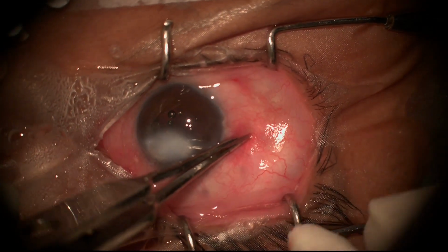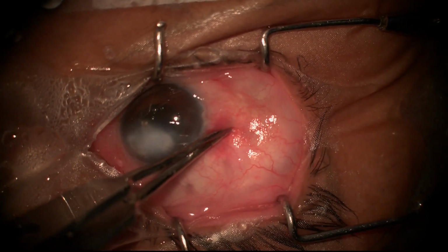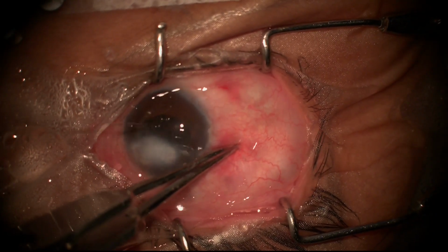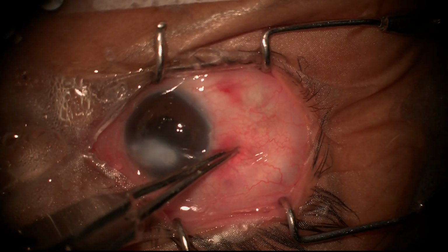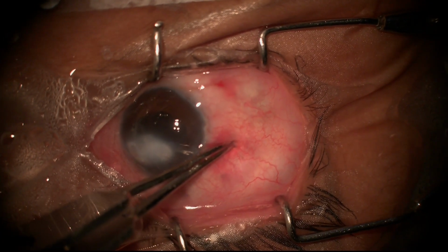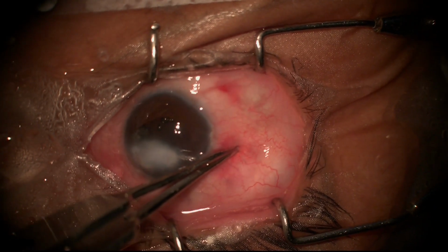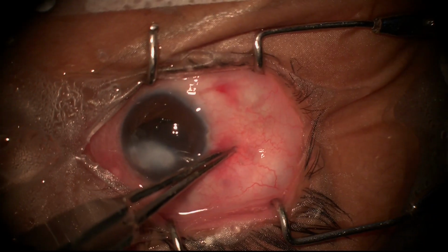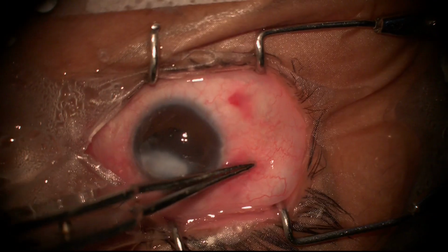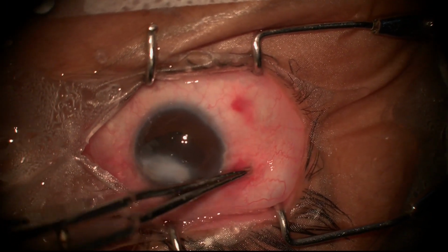Now, doing a buckle surgery for her usually would have been very difficult because indirect is very much affected by that corneal opacity. Although the optics are nearly the same, here you have very very fine control. See, with indirect, you keep on moving the lens, you keep on moving the head. You cannot have a very stable view if you have media opacity. Here you can simply stabilize everything and see through that particular area which is clear and believe that it will work. It has stopped leaking.